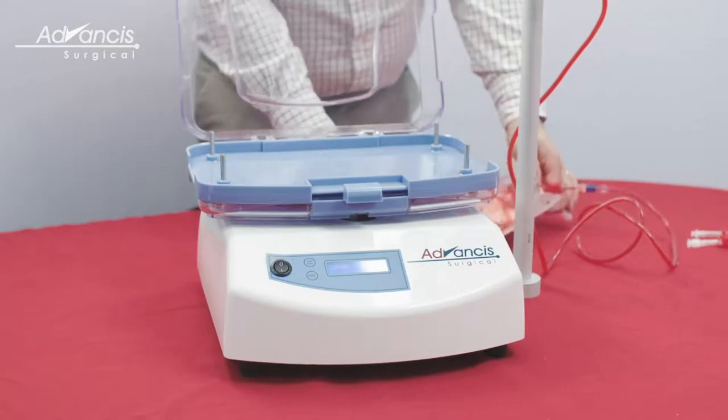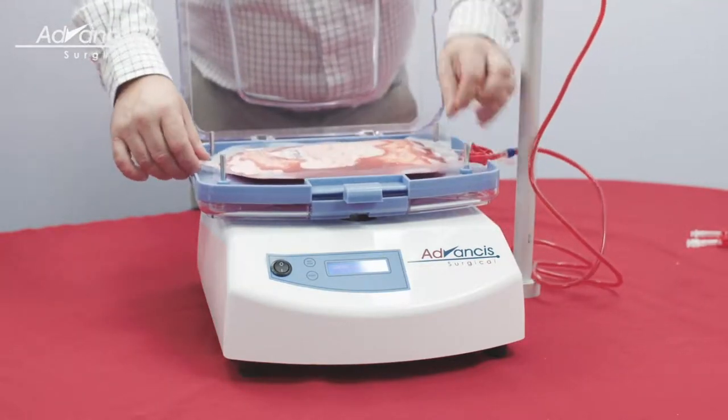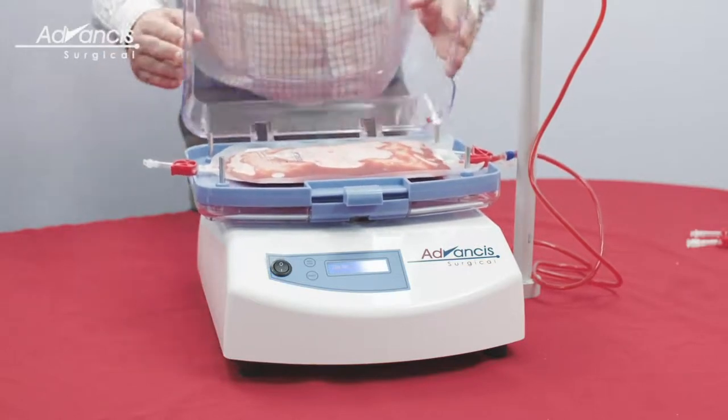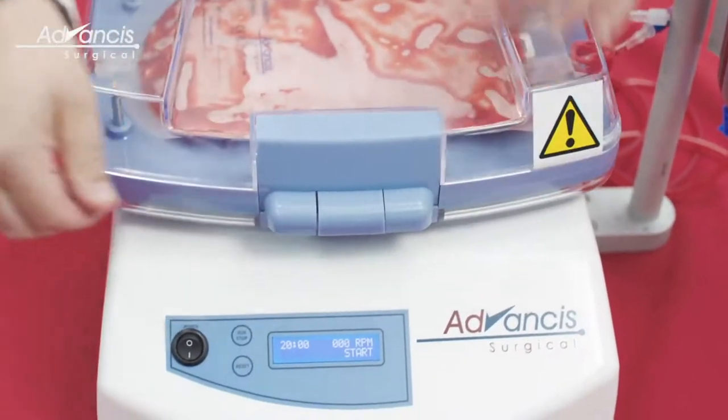Place the cell concentrator bag onto the shaker unit, ensuring that the bag is located on the metal locating studs. Close the lid on the Hemosep shaker and press the start-stop button to start processing.